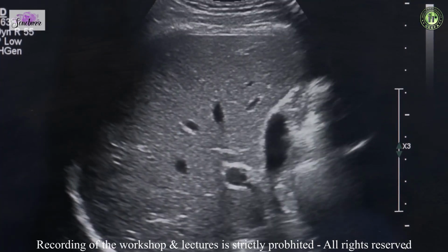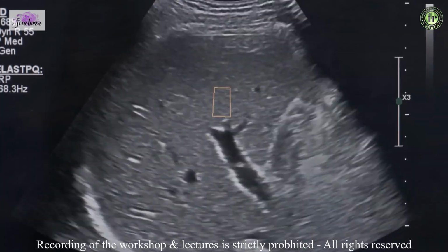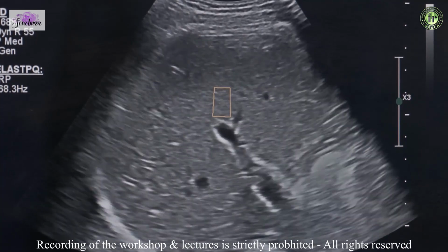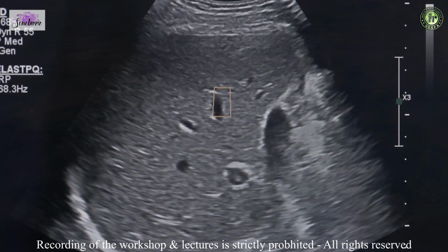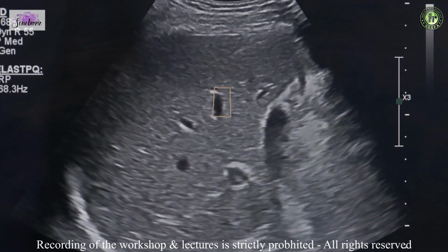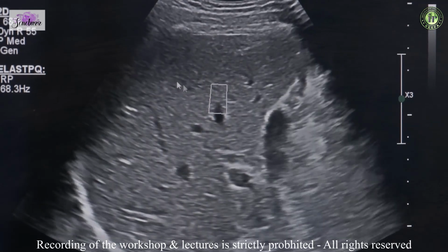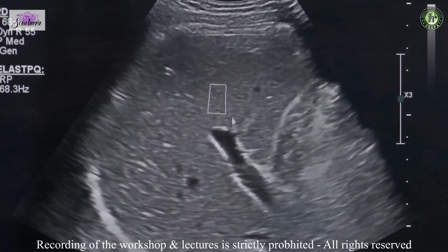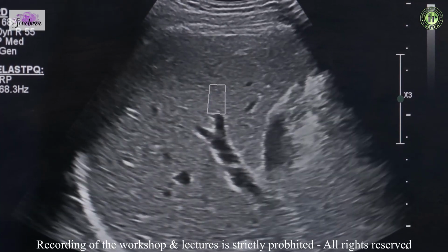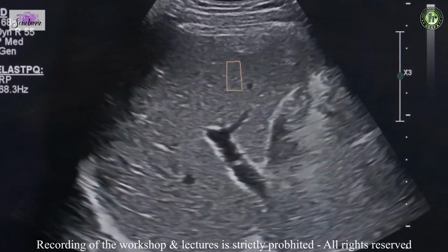Normally on the machines we have two types of elastography modes. The most common is point elastography, which over here is called Elast-PQ. This is what the Philips machines call it, but of course all the different vendors will have their own ways and their own terminology. In this, if you can see this box over there, it is roughly 1 centimeter square in size, and this is the box where we are going to do the readings. We place this box roughly 2 centimeters below the capsule of the liver.